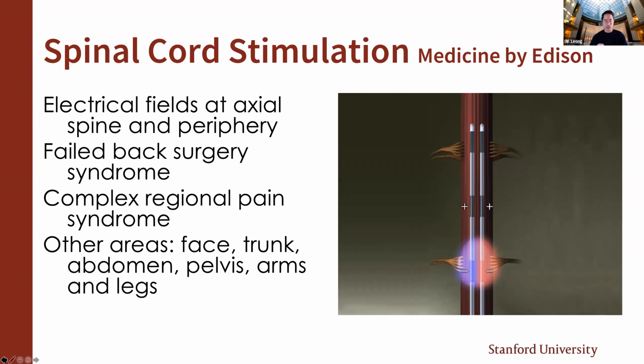We've been doing trials and treatments for all what's listed below, including abdominal pain, pelvic pain, even some non-cardiac chest pain and things like that.